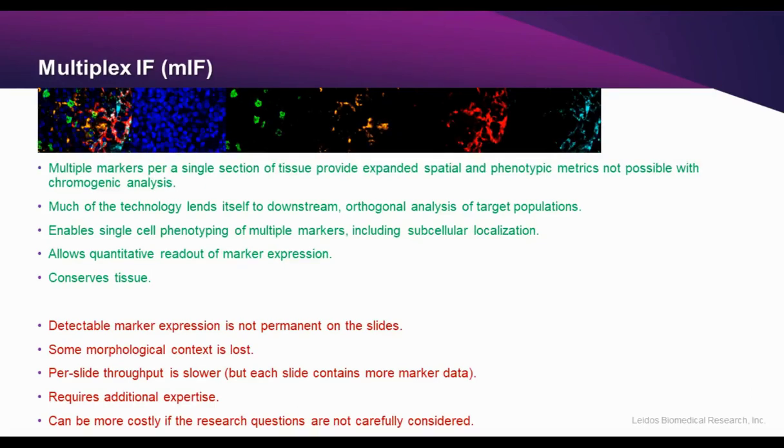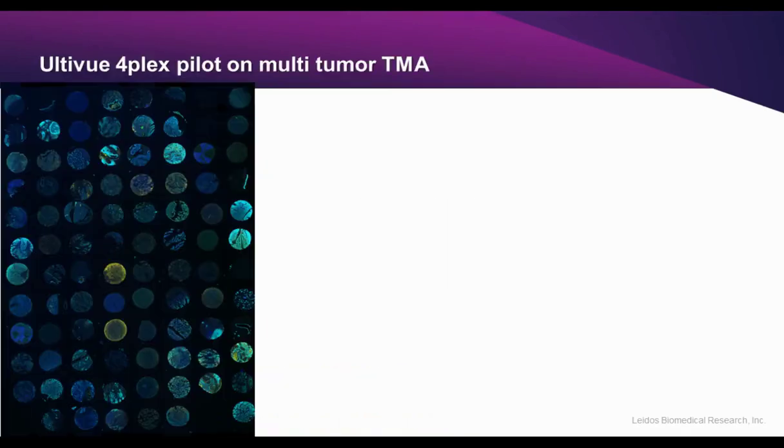Another con not listed here is the increase in image file sizes, needing larger data storage. Large files can take time to move, and storage can be limiting. Advances in storage technology and/or leveraging cloud storage can be a solution for some groups.